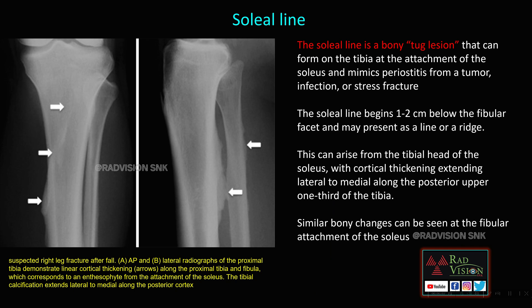Here you can see the soleal line — a linear cortical thickening seen in the proximal tibia and proximal fibula. This is the attachment of the soleus muscle and can mimic periostitis from tumor, infection, or stress fracture. This should not be confused with pathology — it is nothing but the soleal line or a bony tug lesion at the tibial and fibular attachment of the soleus muscle.